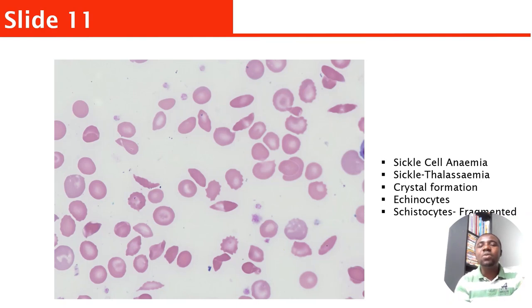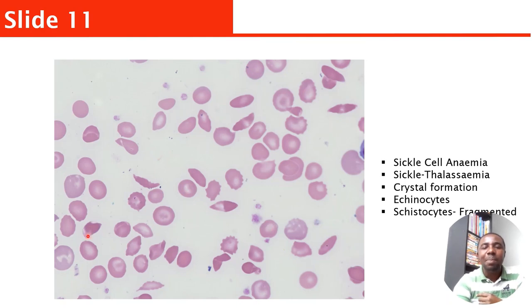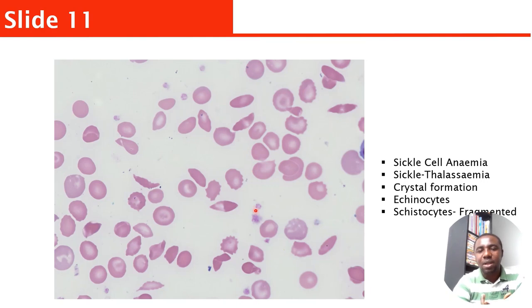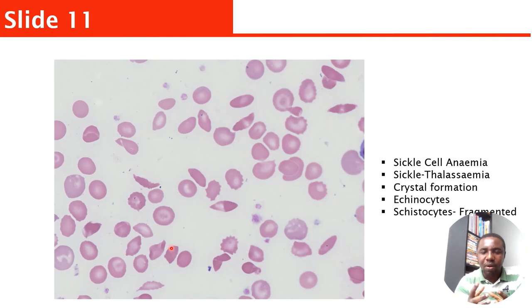This slide is obvious — you can see sickle cells. This is sickle cell anemia. There are also some crystal forms of red blood cells visible. Once you see this, mention that this is sickle cell anemia or sickle cell disease.